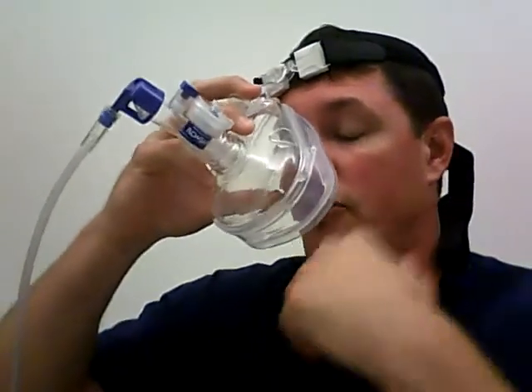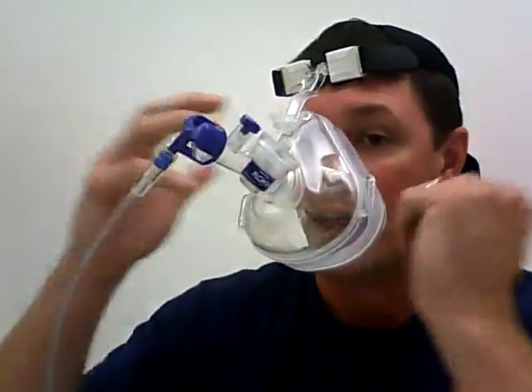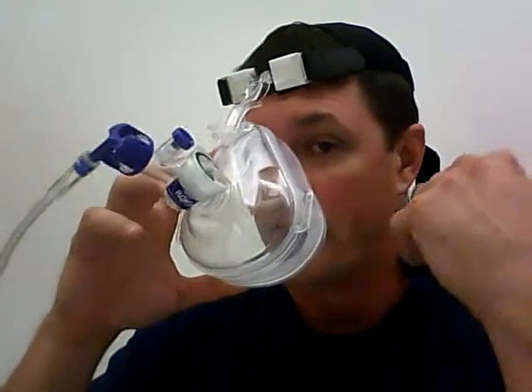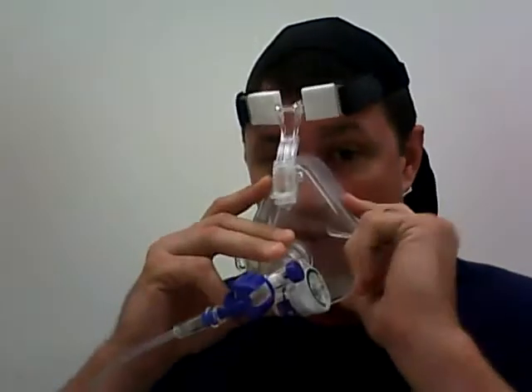It's important when you're putting this on that you get a proper seal all the way around. If you don't get a proper seal, then that air is not going to be forced in the way it's supposed to. So after you put it on, you want to feel around and make sure there's no excess air coming out on the outside. This is how you put it on.